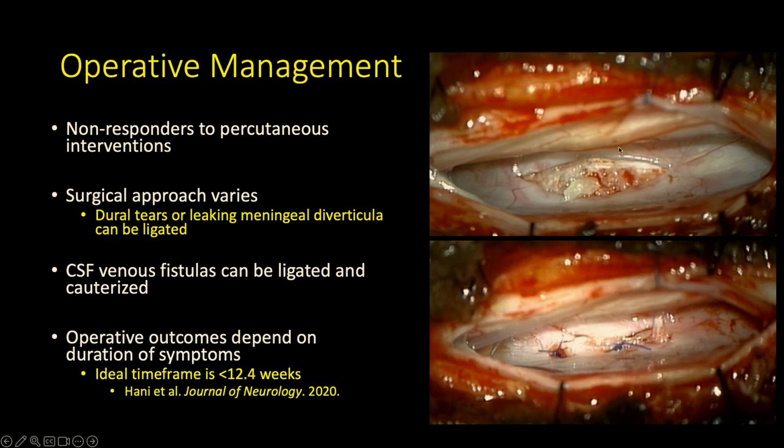And this is a photo from our neurosurgeon at MGH, Ganesh Shankar, who we work closely with. This is a high-resolution intraoperative microscope photo. And here, this is showing this ellipsoid defect within the dura. And this white thing here is a bony spicule from the end plate. And this was resected, and the dural defect was just stitched up, and the patient recovered quite nicely.